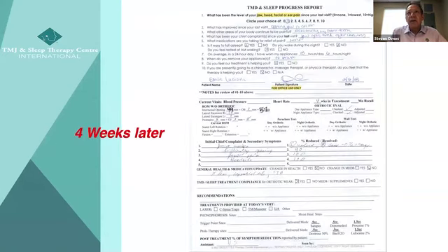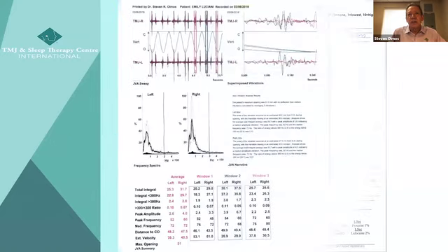So just 4 weeks later, she has full range of motion, 57 millimeters of opening. She says that difficulty opening, facial pain, and headaches are almost 100% gone, but the joint noises are 0% changed. And I thought, that really doesn't make sense for you to have such significant relief of all the other symptoms, but the primary one not addressed. So I took a joint vibration analysis at that point just to document. And these numbers show us that we've recaptured both discs. Now we're down to 25 and 31 from the numbers that we spoke of earlier.